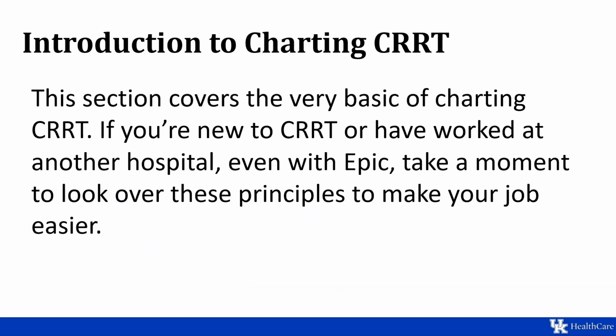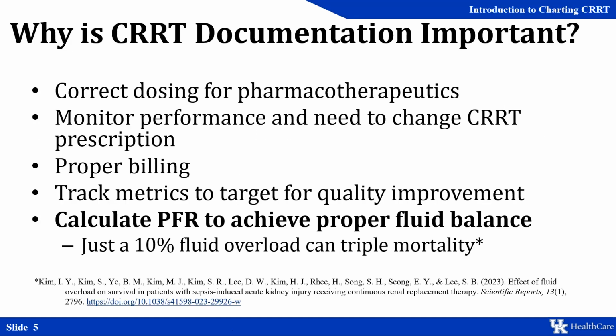We'll start with a basic introduction to charting CRRT, both at UK Healthcare and essentially anywhere else you may work, with some general concepts. Let's talk for a few minutes about why CRRT documentation is important. It often feels as though we're charting numbers simply for the sake of charting numbers. However, they do have a purpose.